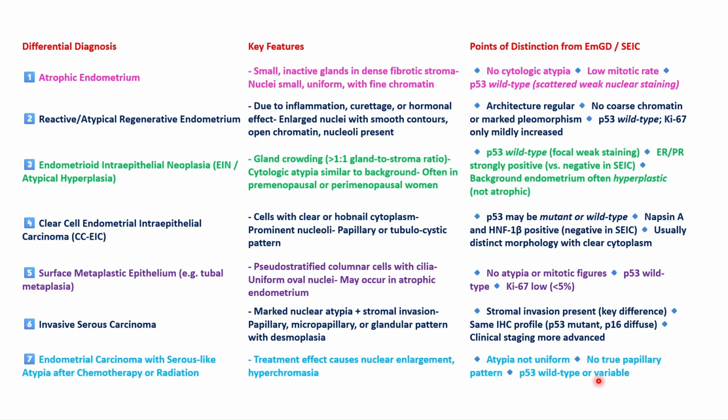Remember, careful attention to nuclear atypia, mitotic activity and P53 expression can help distinguish these lesions from reactive or metaplastic changes.